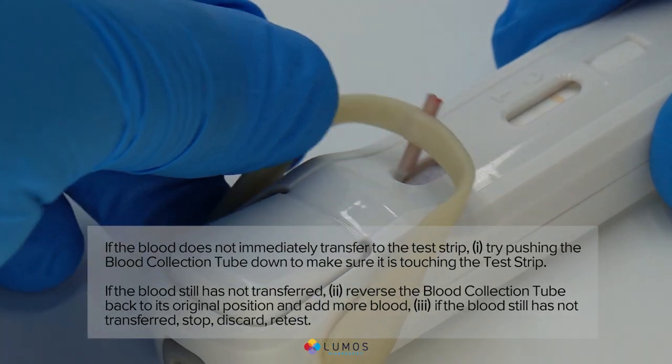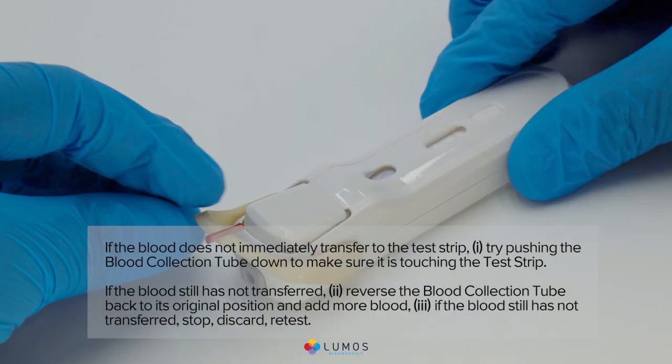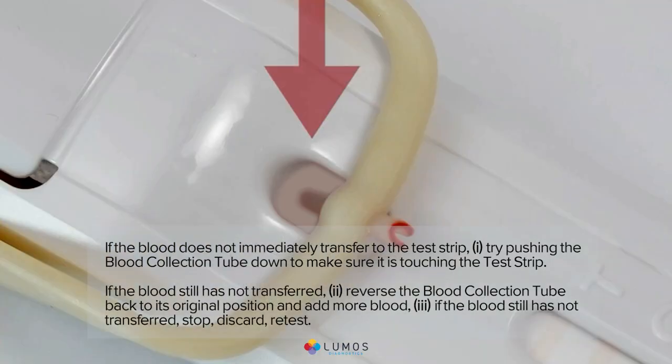If the blood still has not transferred, reverse the blood collection tube back to its original position and add more blood. If the blood still has not transferred after that, stop, discard, and retest.